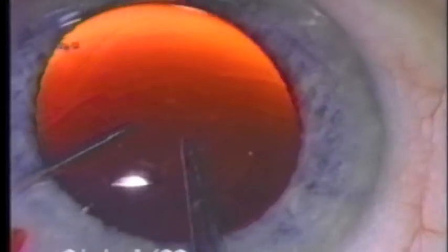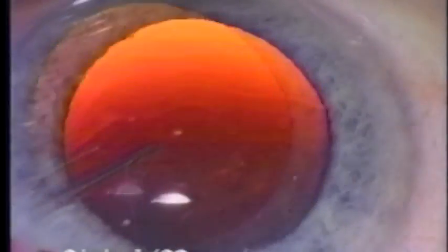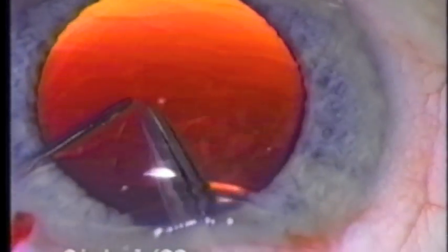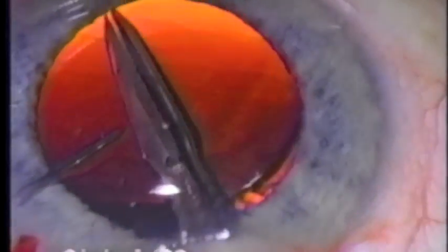This case will illustrate matching an anterior capsule tear. You will note a discontinuity in the edge of the anterior capsule here at about 11 o'clock. With Vanna Scissor, we're going to match that tear in this location. With this matching tear, the segments of intact anterior capsule will be equalized.